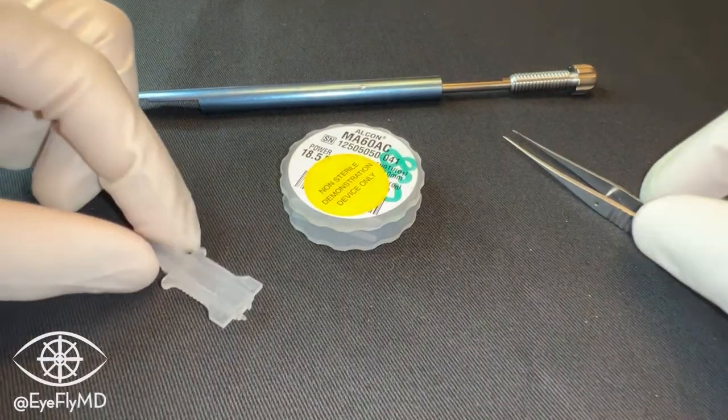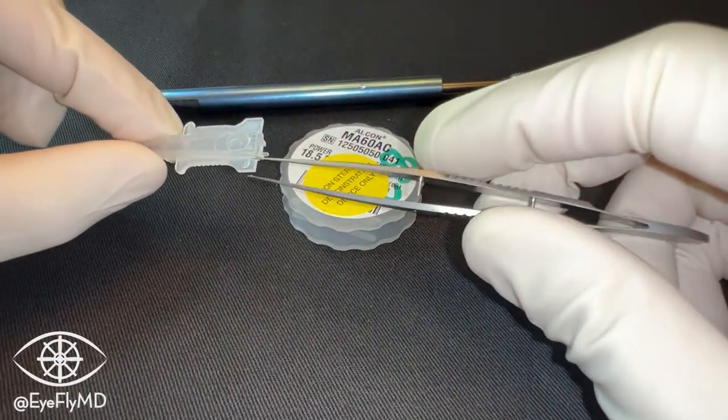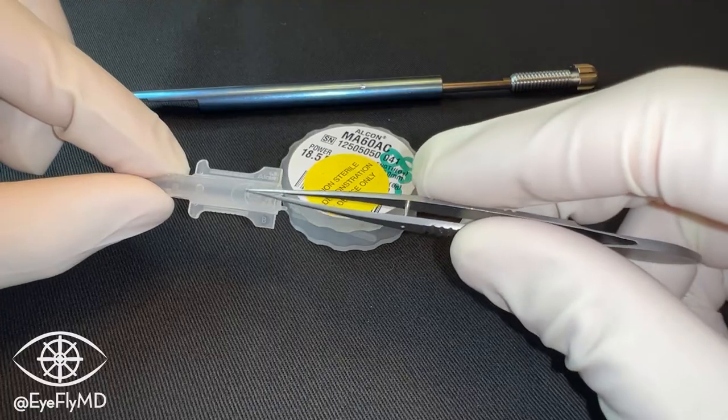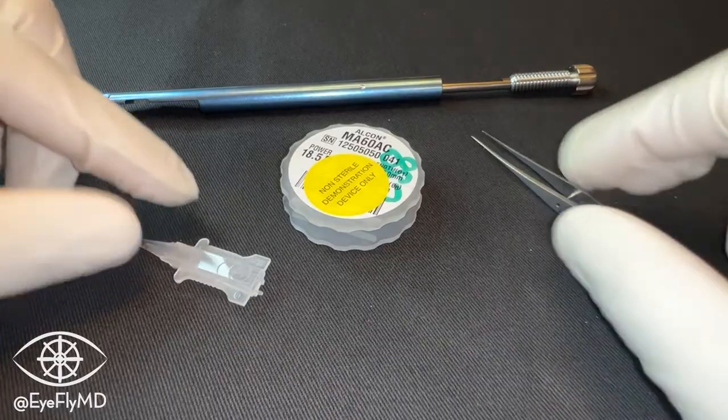Loading a three-piece IOL is very similar with a couple of differences. We'll usually be using a B cartridge — B for big — and we can still see our reminder for orientation of the IOL on the cartridge here.